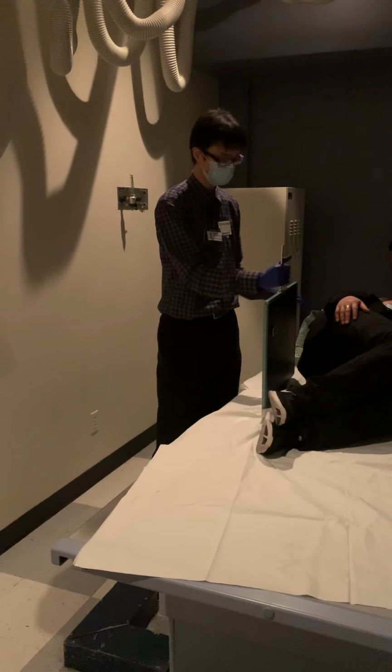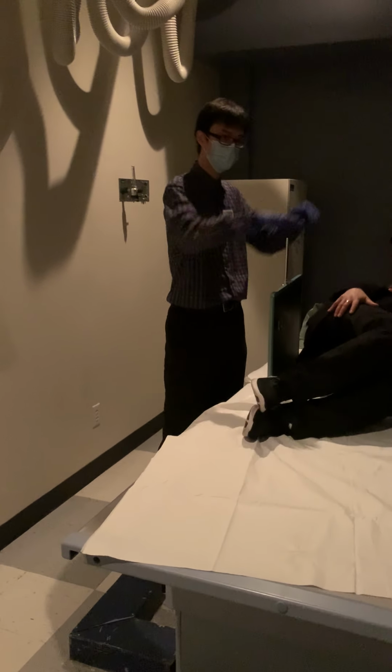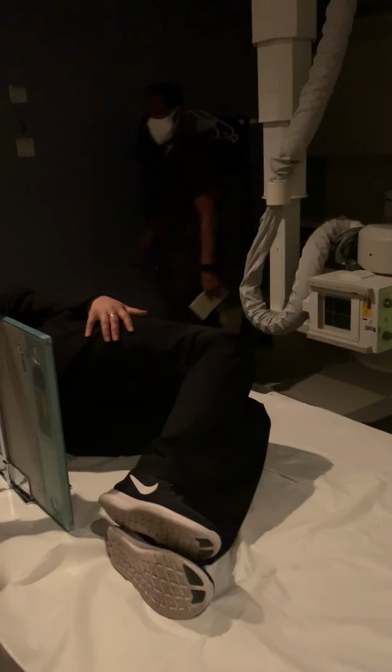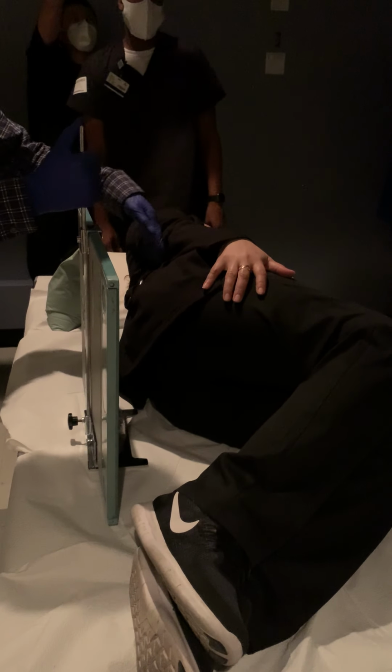Okay, step one, make sure the patient is straight. So come here to the sides, head in front of the table. Is the patient straight? Okay, one, bring this arm up, all the way up to your head. Good. All right.